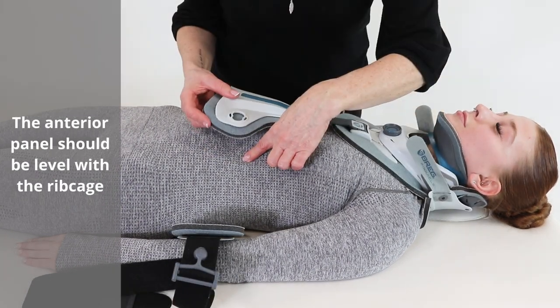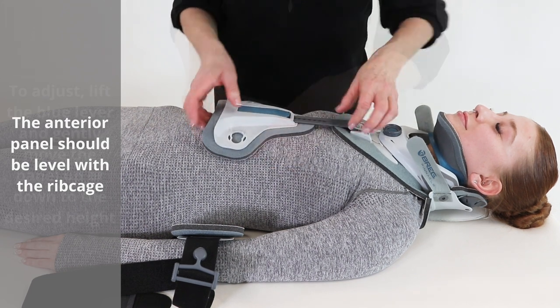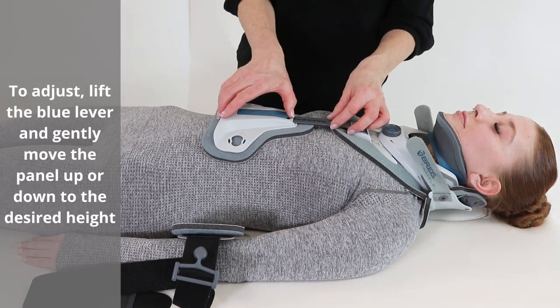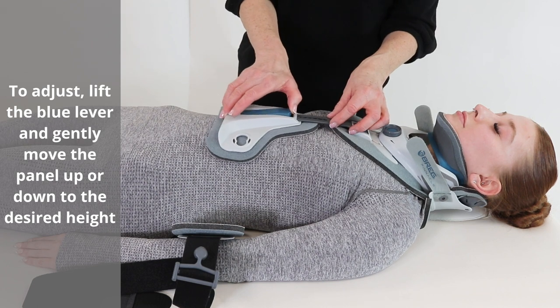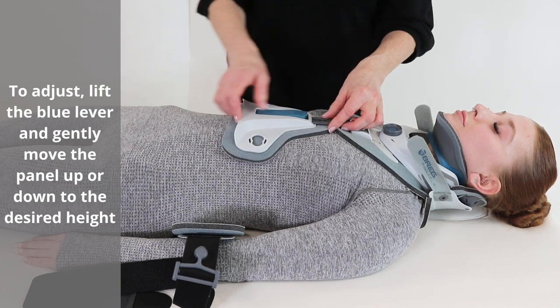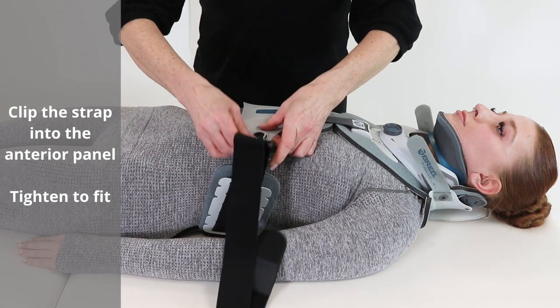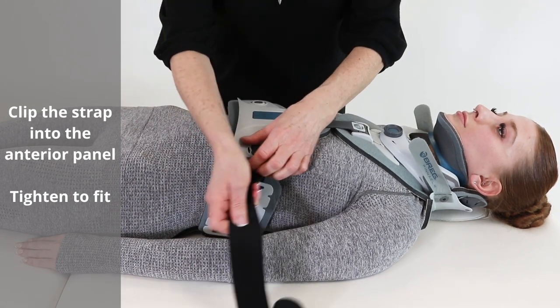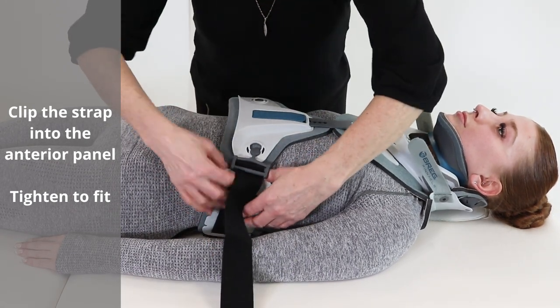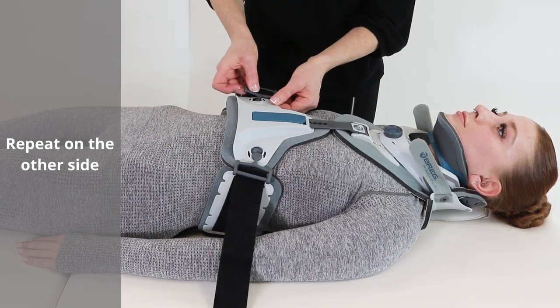The anterior panel should be level with the ribcage. To adjust, lift the blue lever and gently move the panel up or down to the desired height. Clip the strap into the anterior panel and tighten to fit. Repeat on the other side.